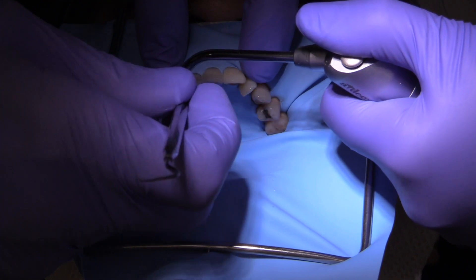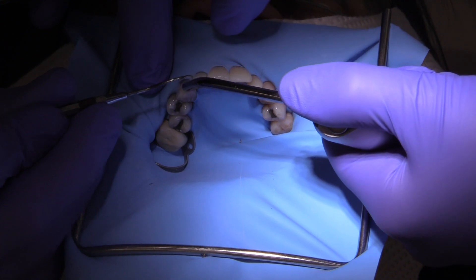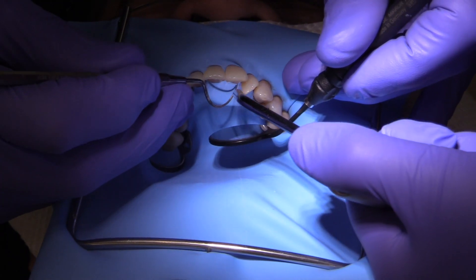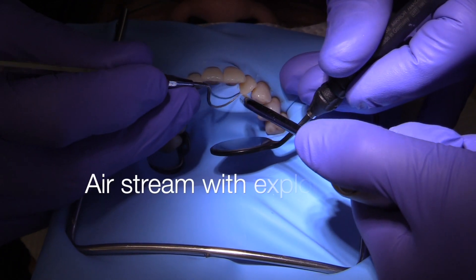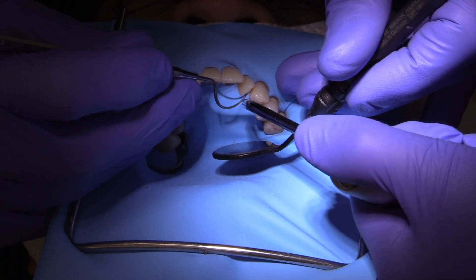The beaver tail burnisher can also be great to use in different areas — the access is amazing and you can get lingually and facially. The assistant has already rinsed off all of the lubricant and is now using the Airstream to blow and follow my Explorer tip so that we can invert the rubber dam.